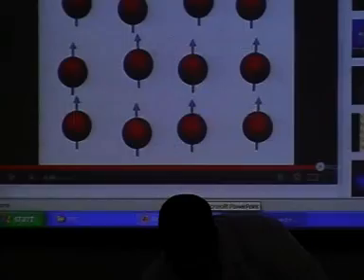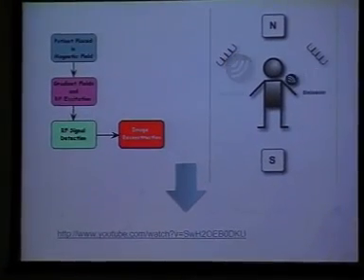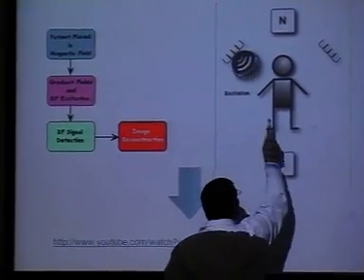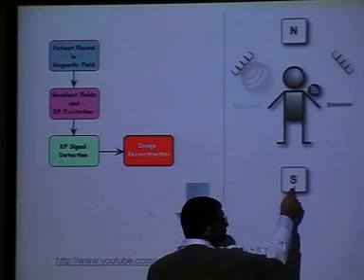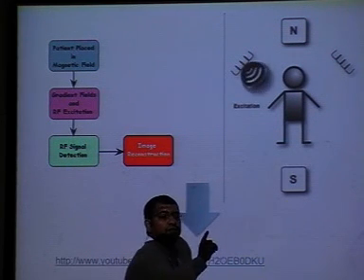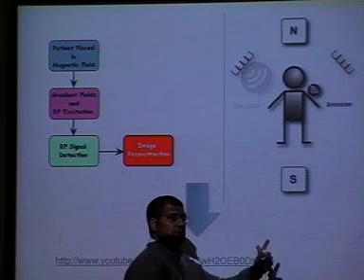Now let's carry on, because this is a good picture that shows what goes on. This is my patient, and that's my Z direction. I first apply my magnetic field, B0. When I apply B0, what happens to the magnetic moments?